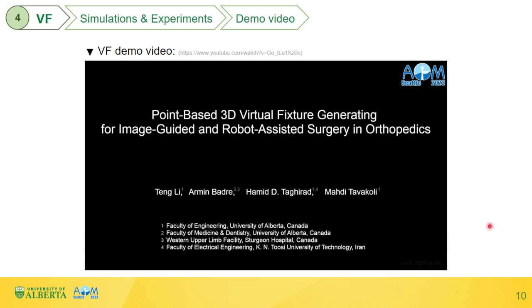This is a demo video of all the simulations and experiments just presented.